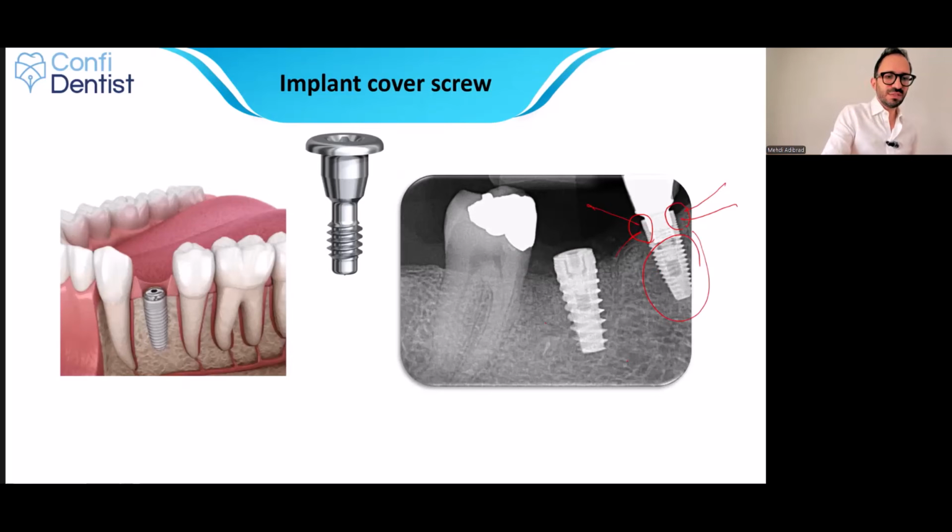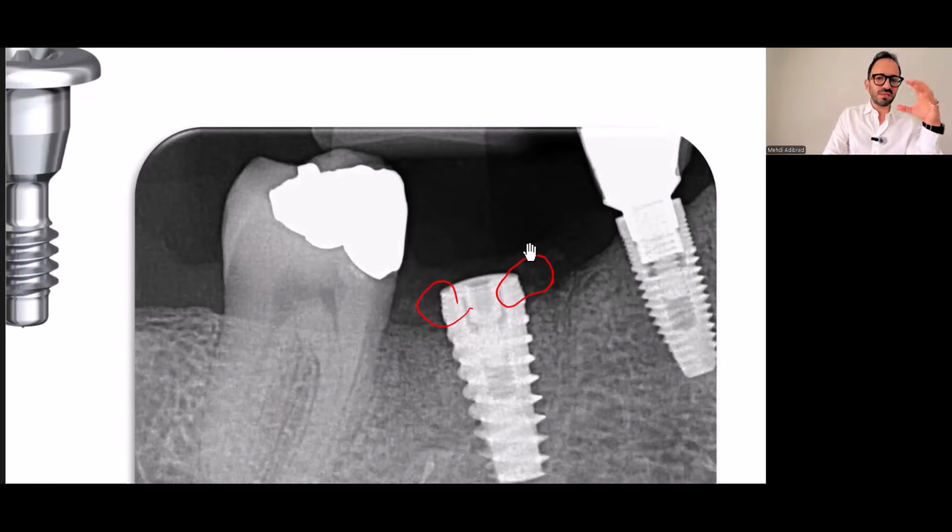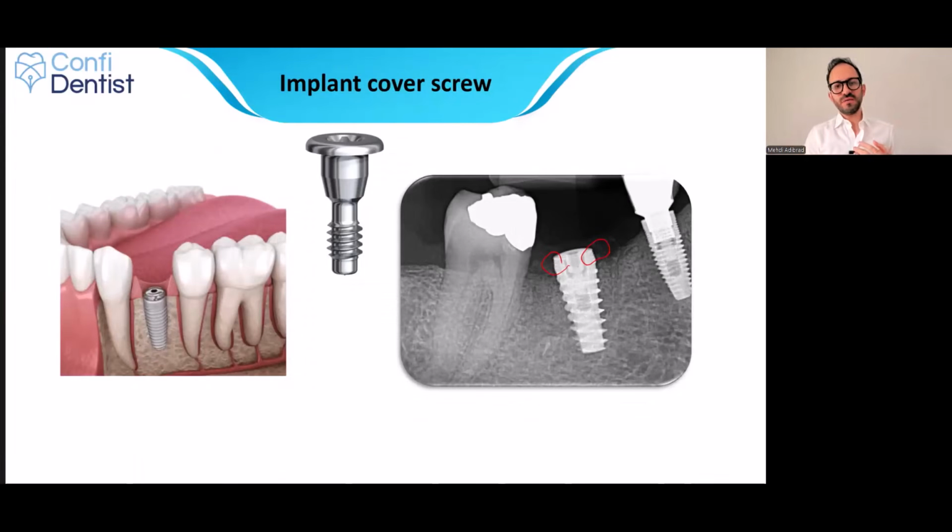And this can be a little bit confusing sometimes because in some implant designs, these micro threads are very, very delicate. They're very fine, and it may give you the idea that, okay, is this a tissue level implant or not? But if you pay closer attention, you can see some irregularities. And on a tissue level implant, we never have irregularities and a smooth collar. We call it a smooth collar of the implant in a tissue level. We don't have that feature. It's just very, very smooth, absolutely no irregularities. Okay.